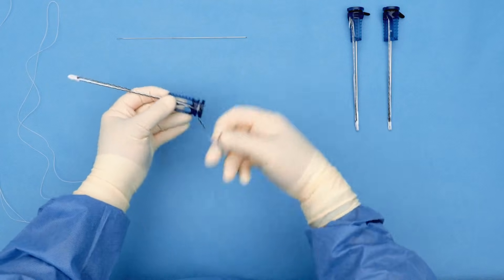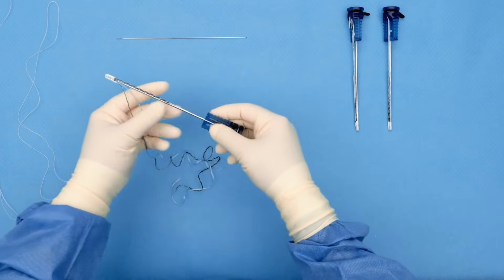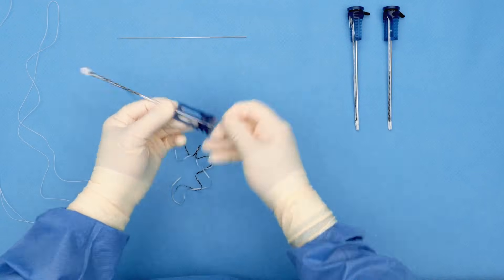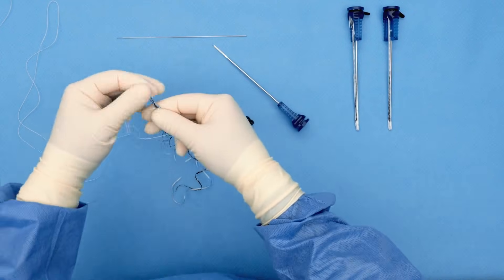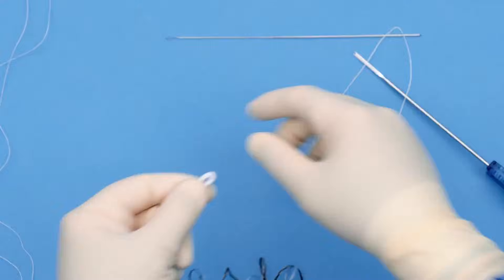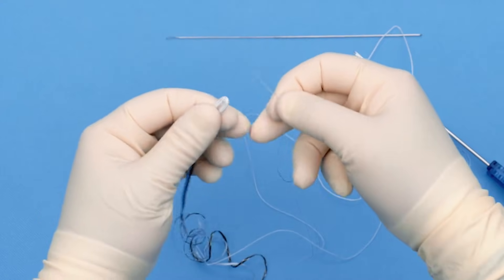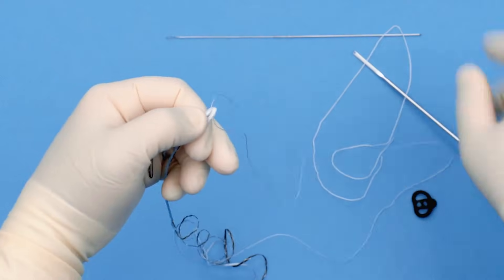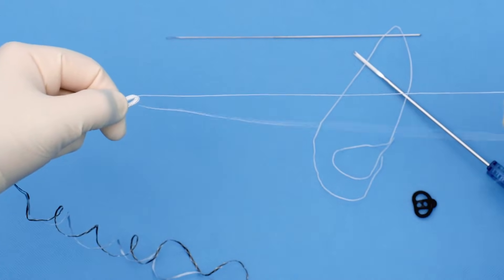For this technique, which is a pull-in technique, we are not going to be using the metal inserter. Instead, I'm going to unload the anchor so that I can free up the apex of the anchor. You also will not need to have the safety suture. And to pull it in, you're going to use an O fiber wire suture that will be placed at the apex of the anchor.